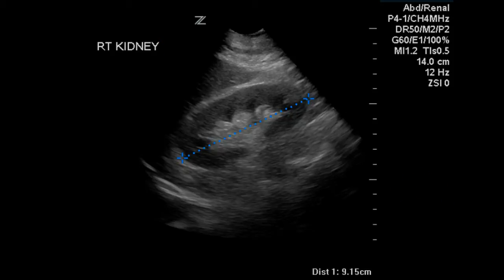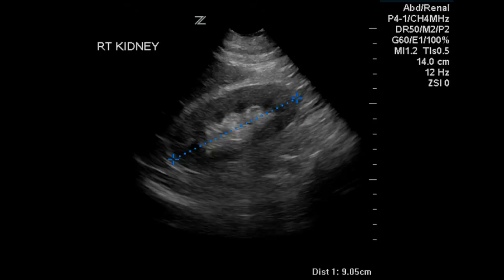Another image of the right kidney — the length in this image measures 9.15 centimeters. And a third measurement: this measurement is 9.05 centimeters, which is normal, although at the low end for a right kidney.